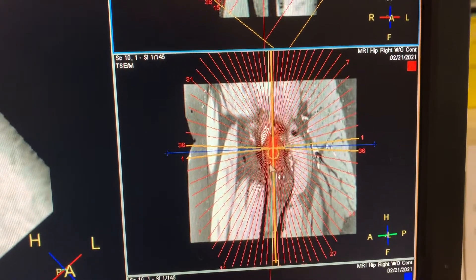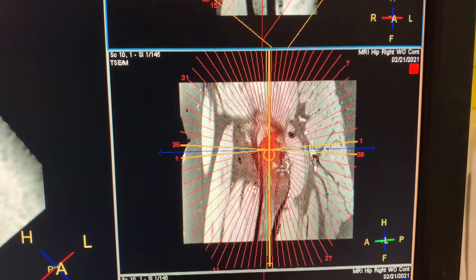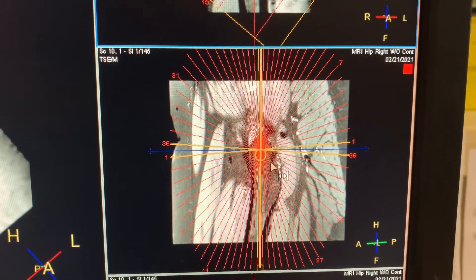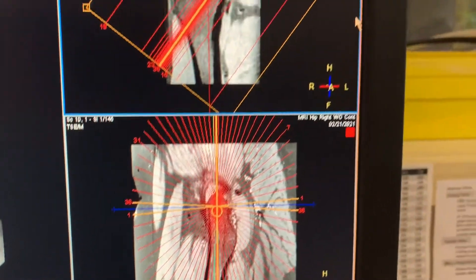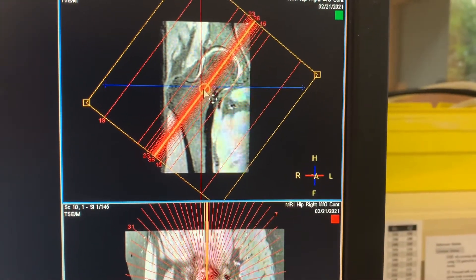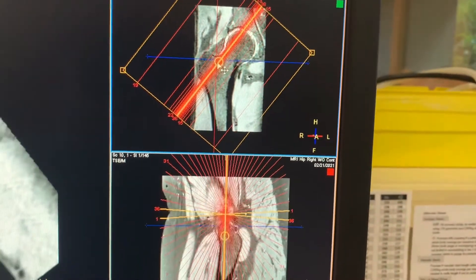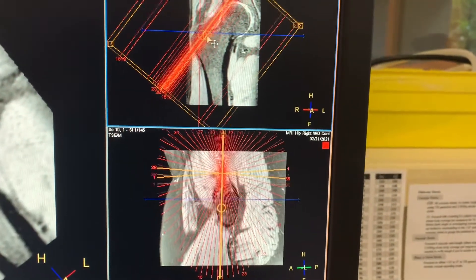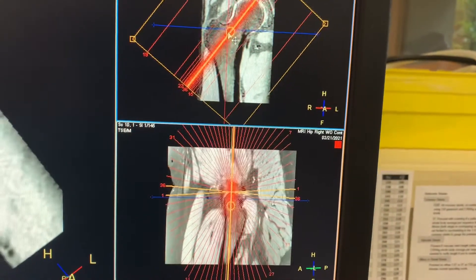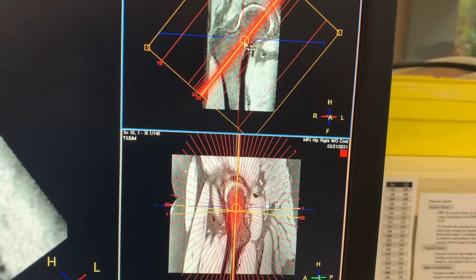Once you angle that, go back and angle it with the femoral neck on the sagittal view. However, if you cannot see the neck properly, go back up top, click on the circle, and by shifting the circle left or right you'll be able to move in and out of the bottom image. Now I've got the femoral neck perfectly right there.